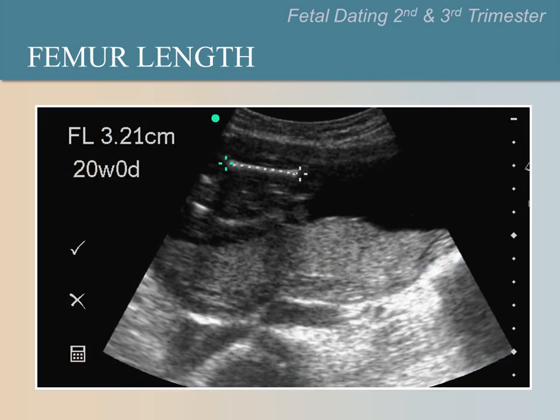Is this femur length measurement correct? The answer is yes. How could the image be improved? Please pause the video now to discuss in the group. The answer is that the image is too small. Adjust the depth to enlarge the image.